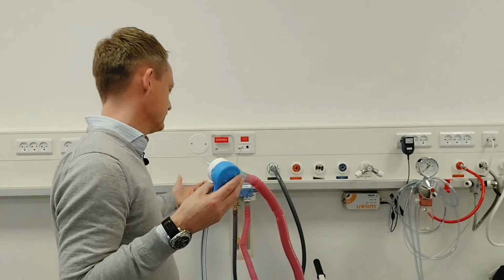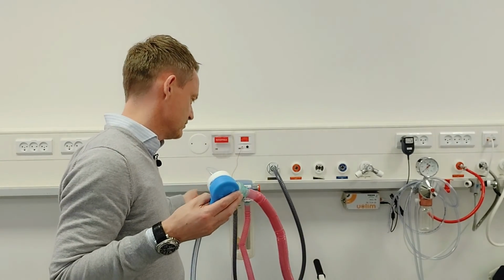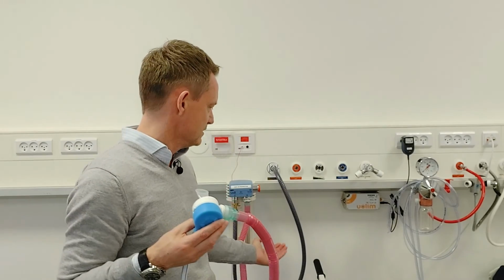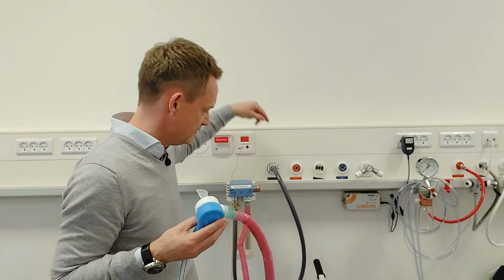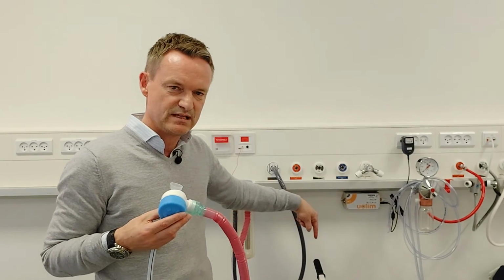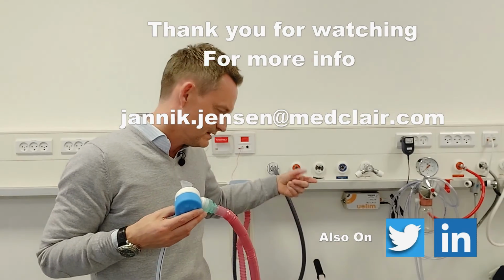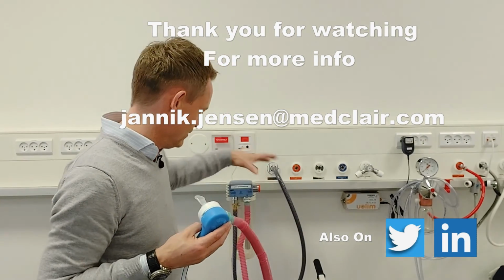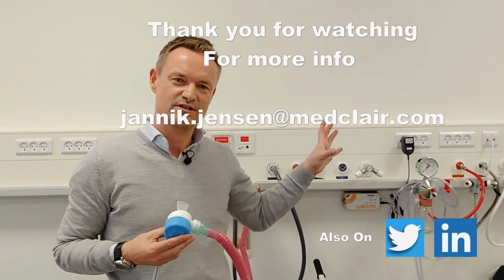My buffer will collect all the expired gas from the patient. That will contain a lot of N2O. The N2O will be sucked up by this system, the AGSS, and the AGSS system will then take that down to the basement. In the basement there is an AGS pump, an active AGS pump that will suck up all the gas that I have in this container, this buffer, and lead it over to a central destruction system.